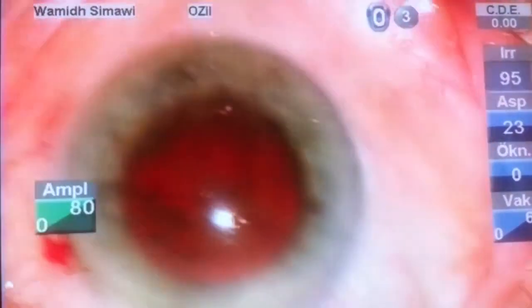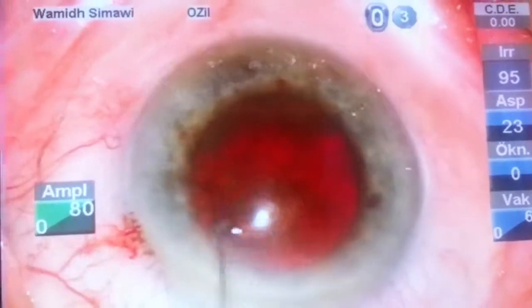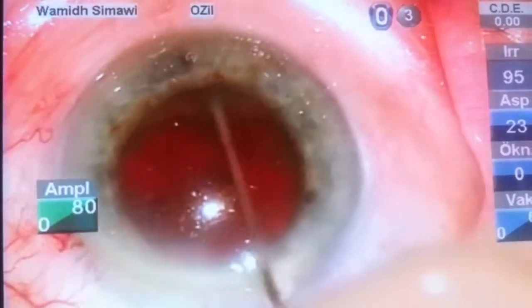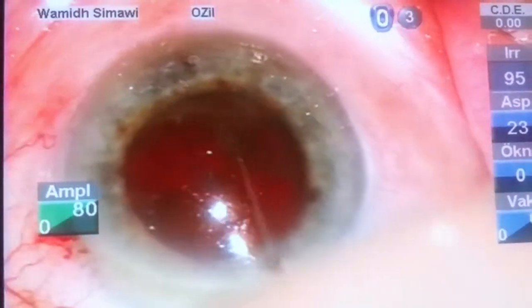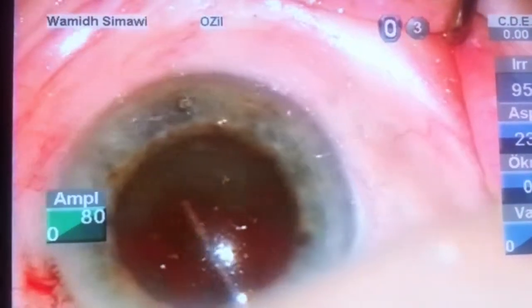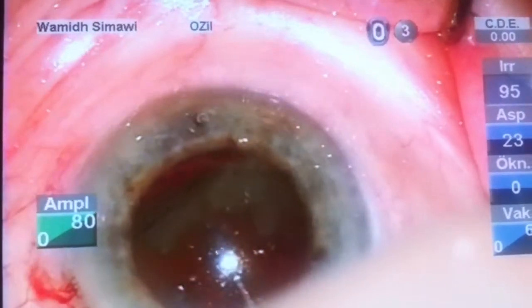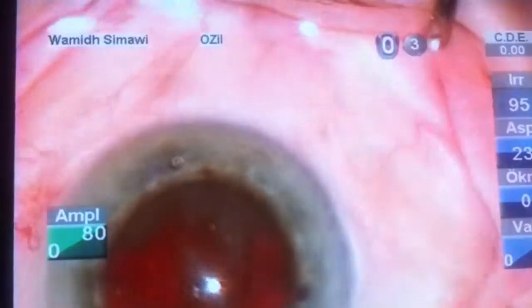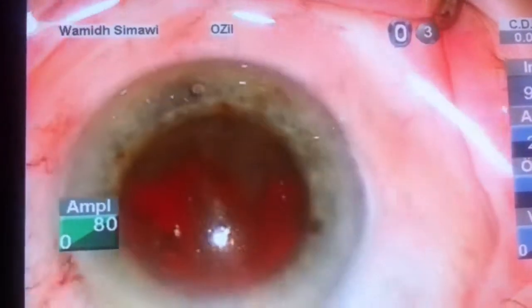Hydrodissection of the hard nucleus — in this case it is presented as one big piece nucleus. We don't see any signs of liquid cortex or epinucleus, so proceed slightly and carefully to avoid zonular stress.